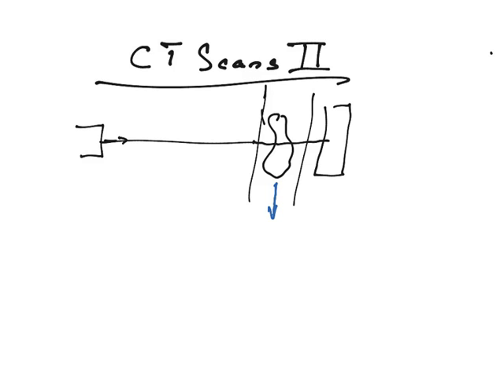And once you go through one full pass, then this object is rotated around by 1 degree or 2 degrees or however, and then the object slides back the other way. So now the beam goes through again, coming back the other way. And this process continues until such time as the object has been rotated a full 180 degrees, and this beam can sweep through the full object all the way around. So that was the prototype, and it worked.